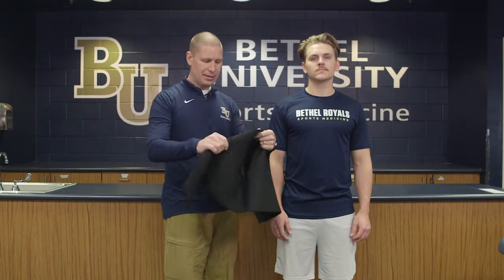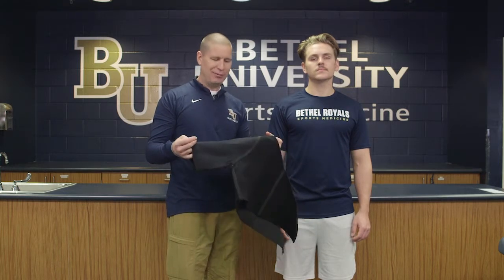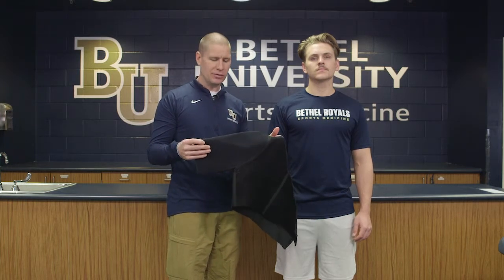The way it's designed, it has this particular device which is really just a neoprene half-vest that they place on. Then it has the ability for the straps to hook onto it — this part doesn't really do much on its own, it just provides the foundation for the support of the straps.